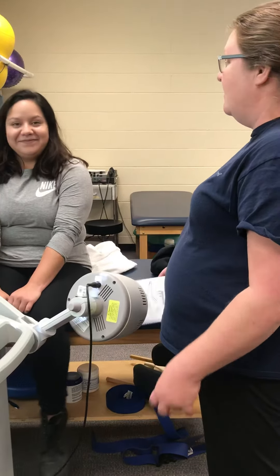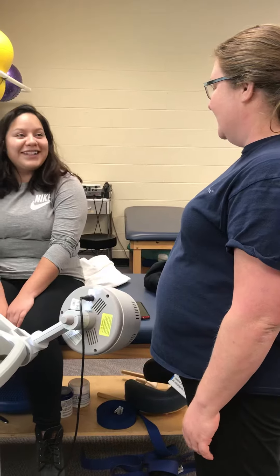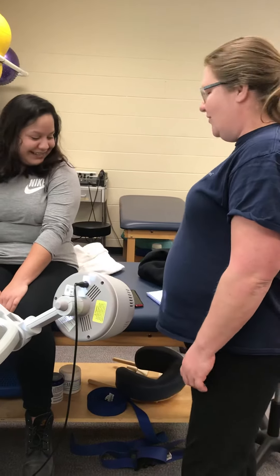Do you have any metal or blood clots? No. Are you pregnant? I'm not pregnant. No pacemaker? No. Okay. And like I said, this is just going to improve your range of motion.